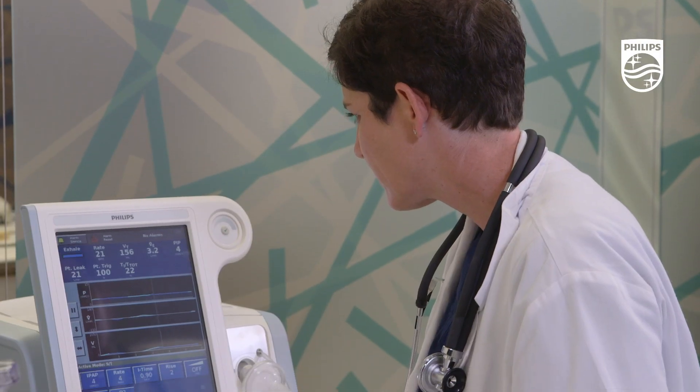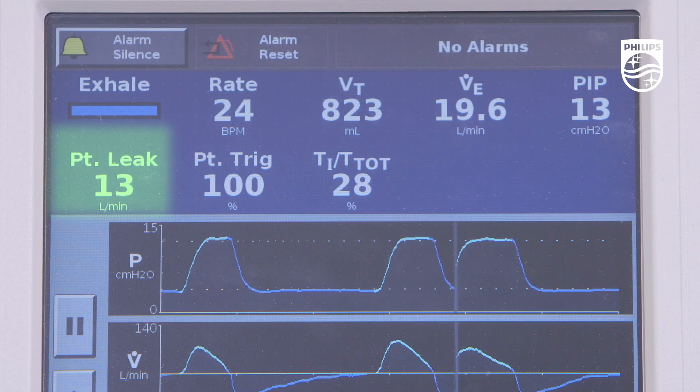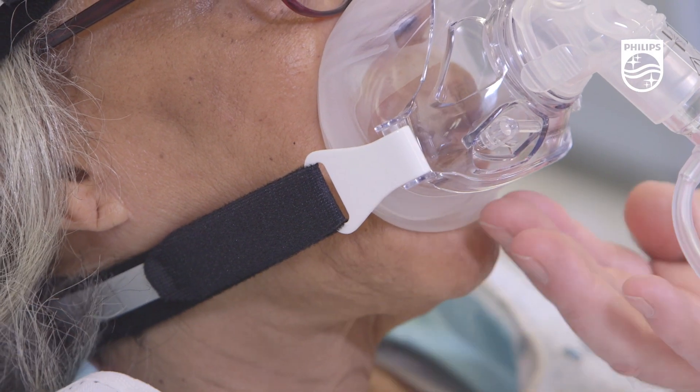During non-invasive ventilation, it is recommended that you have a patient leak, and this leak should occur at the bottom of the mask near the chin.